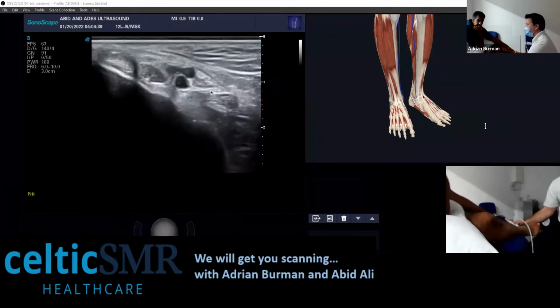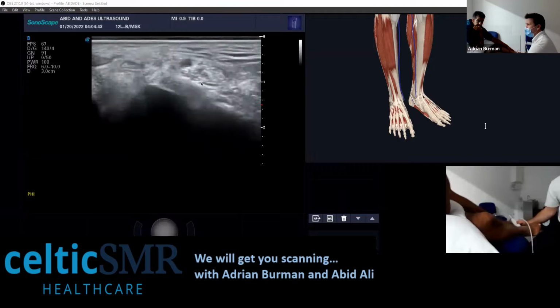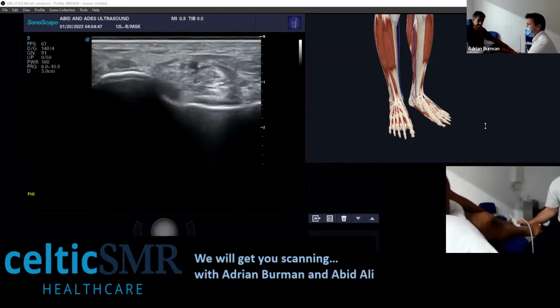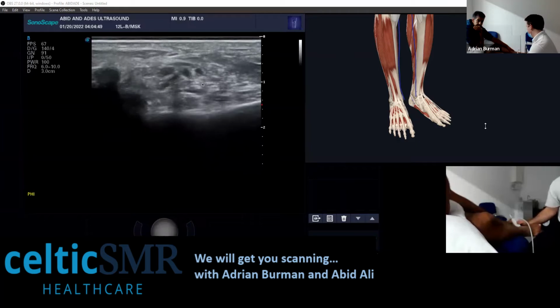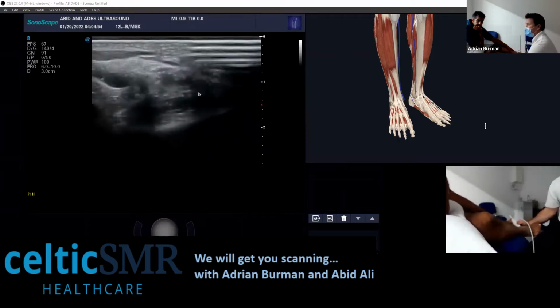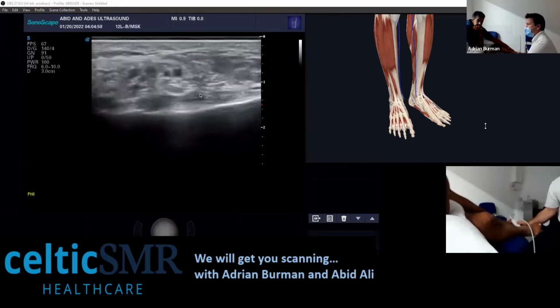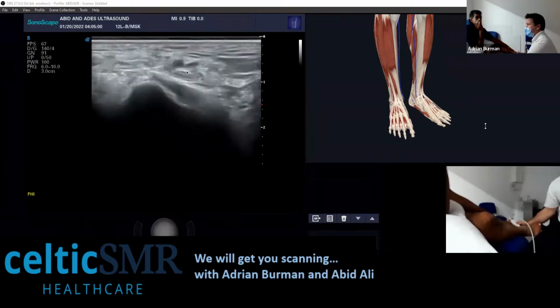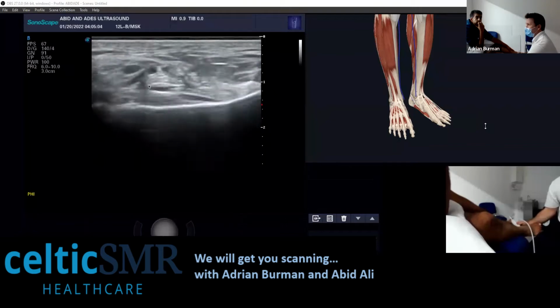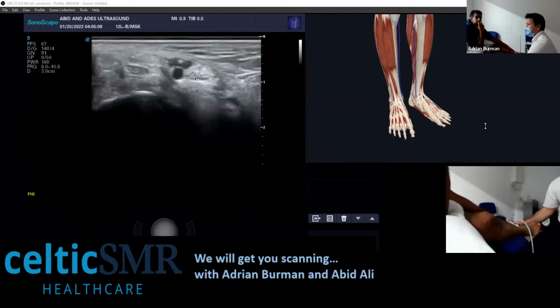Now, I'll trace it down into the tunnel, but unless they're specifically looking, I won't trace it to the medial calcaneum unless I see anything or am specifically looking. I just tend to go down to the tunnel and interrogate that area, and you can see them splitting off here anyway. That's how I tend to look at it.